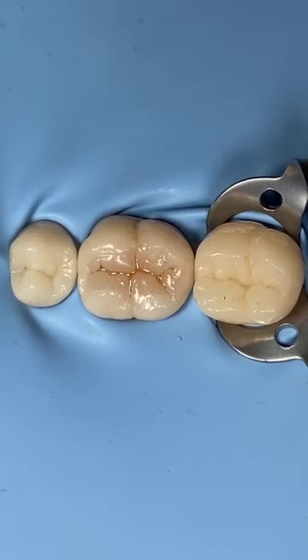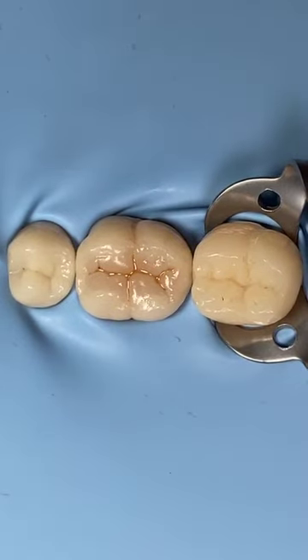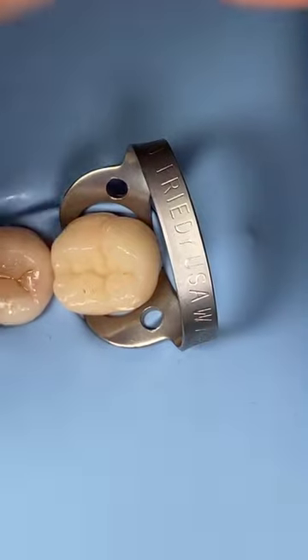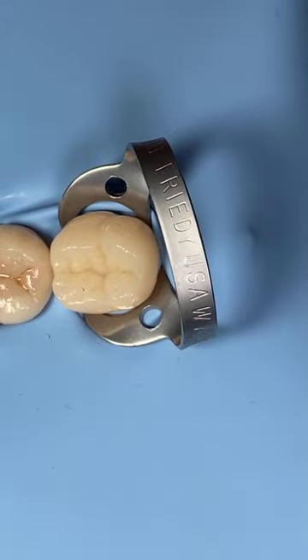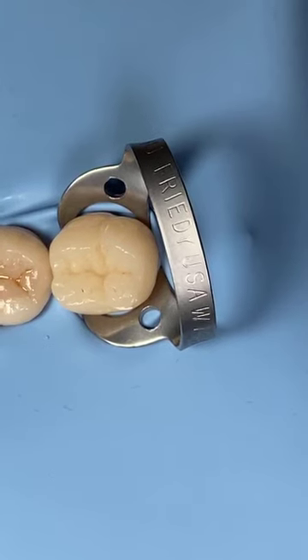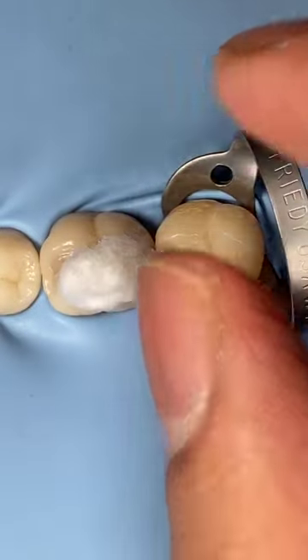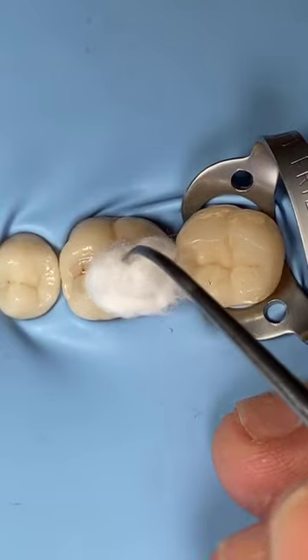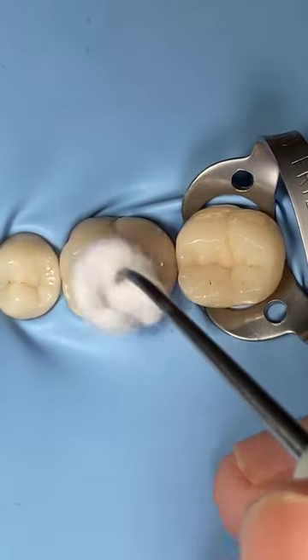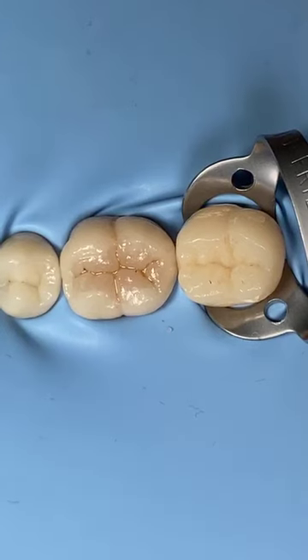And then instead of using a microbrush, you know, microbrush is a little bit pricey, right? So don't waste too much brush here. Instead of using a brush, I would like to use cotton, a cotton pellet maybe. I don't have any tweezer here actually, oh my god. It's okay. Okay, you can use your cotton here. Pardon me for not having a tweezer. You can use tweezer and then rub it just like this. Rub. Even better if you have tweezer.